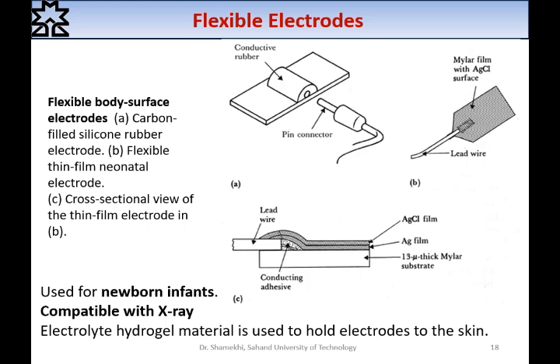Also for recording from infants. The infant's limb is small, therefore we need to use a flexible electrode to connect correctly to the limbs.